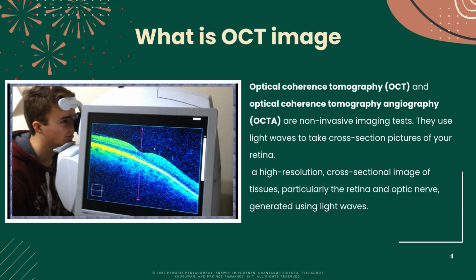OCT, or optical coherence tomography, is a non-invasive imaging test where the doctor uses light waves to take a cross-section picture of your retina, which the doctor can use to detect diseases that you may have.